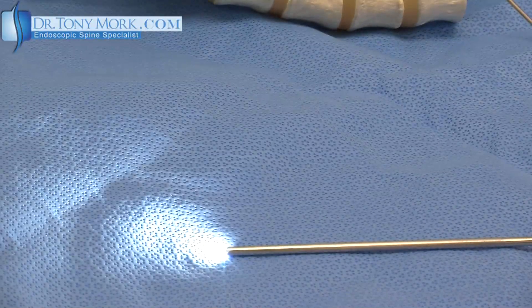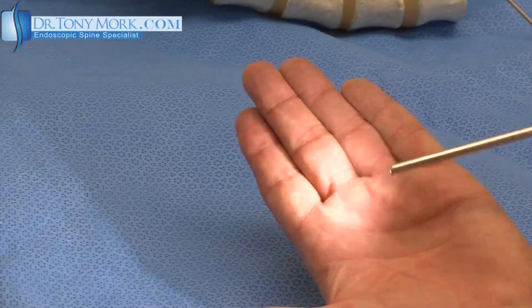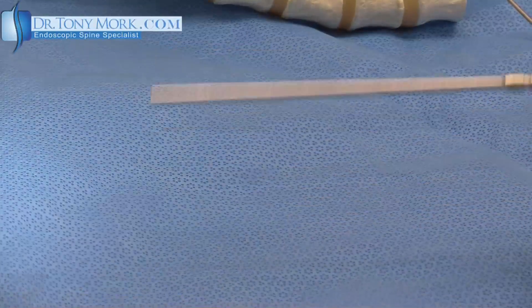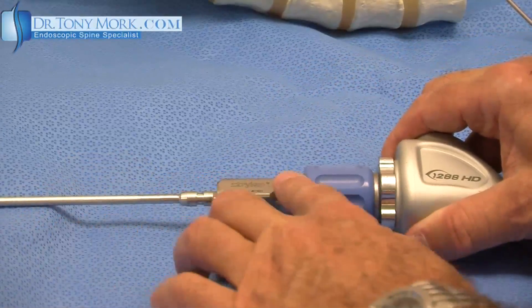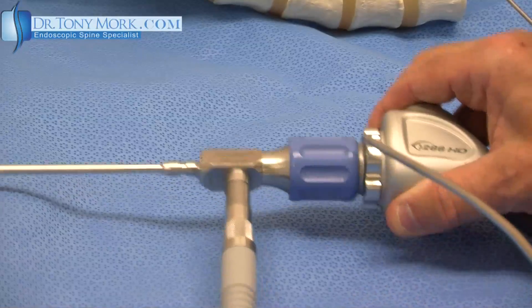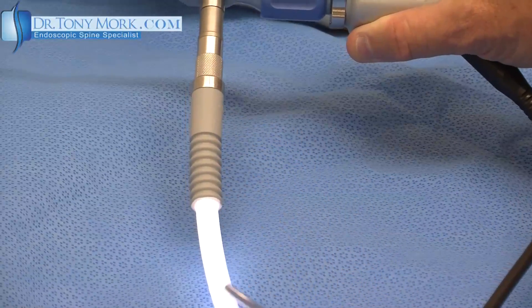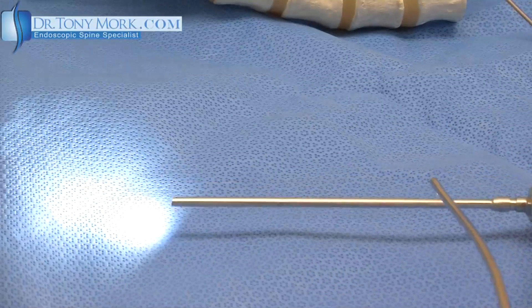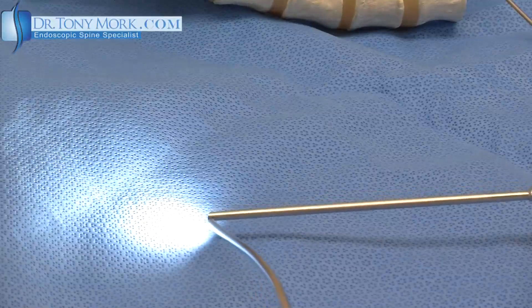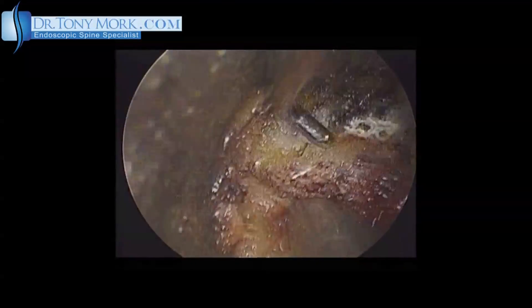Endoscopic spinal surgery is possible because of this. This is a light source at the tip with a lens and a magnifying glass and a camera at the top. The endoscope attaches to a camera here. There is a light source here and, by flexible fiber optics, the light is conveyed down a straight shaft right to the tip, where there's a lens which attaches to the camera and a light source.